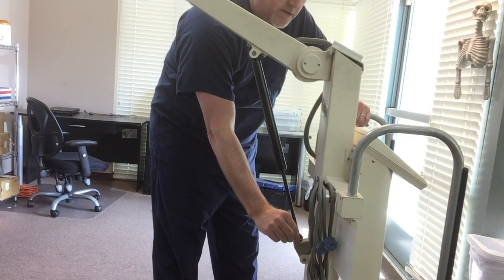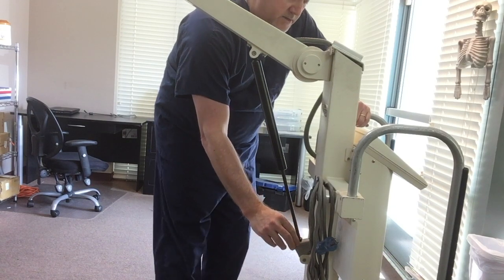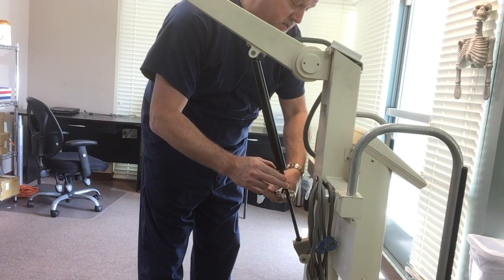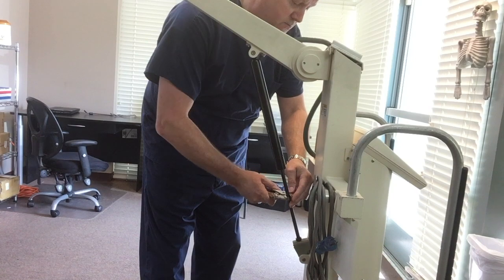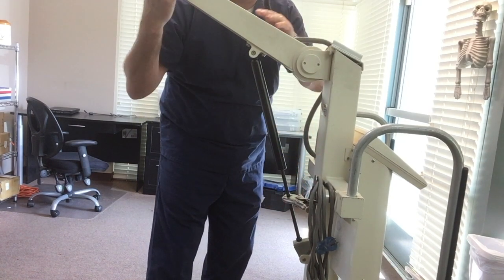What you do is loosen the retaining nut at the bottom here. Take a good pair of vise grips, lock them onto the skinny part of the piston, and turn it counter-clockwise 180 degrees.